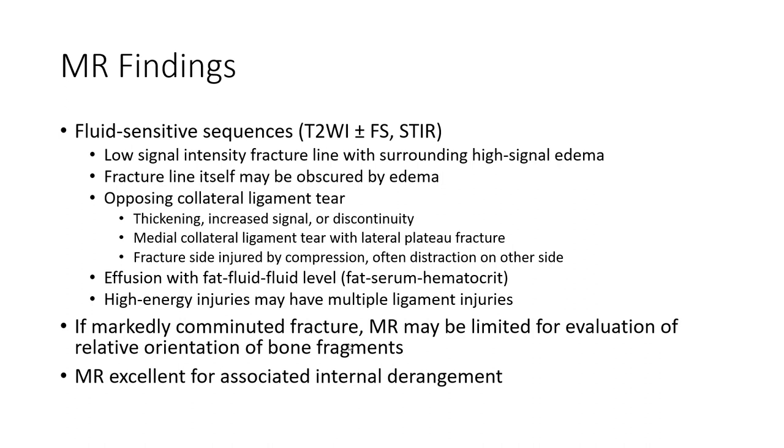If markedly comminuted fracture, MRI may be limited for evaluation of the relative orientation of bone fragments. MRI is excellent for associated internal derangement.